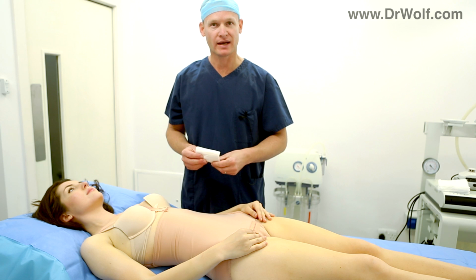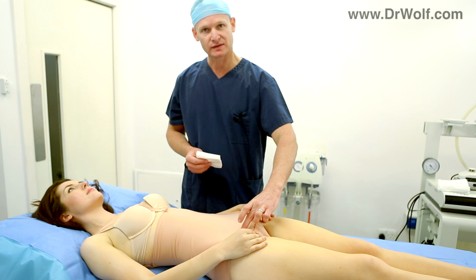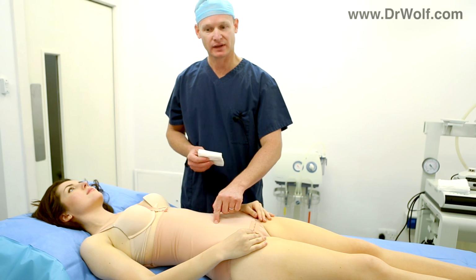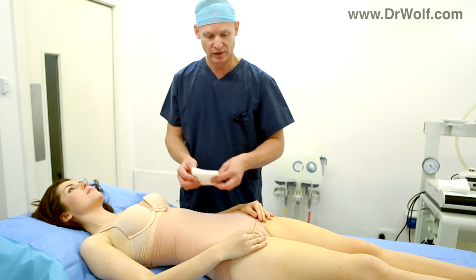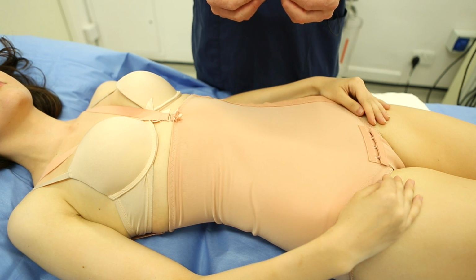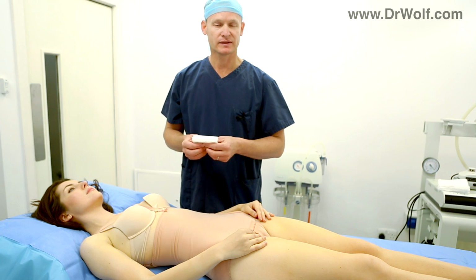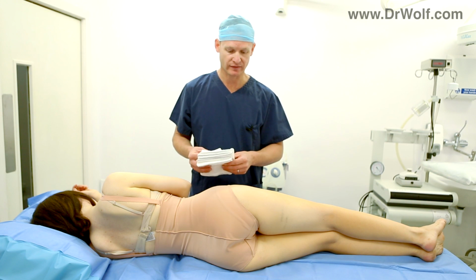I'm going to show you now where the access points for the treatments are on an abdomen. I tend to make 2 in the lower part of the tummy, and these are usually in the bikini line so they're not visible. 1 or 2 in the umbilicus, again they're in the umbilicus so they heal very nicely, and then 1 on each side underneath the breast crease. And this is where you really need to place the padding to absorb any of the leakage of the material. And that will be of this type after the first 48 hours, during which the leakage will simmer down to just a trickle.